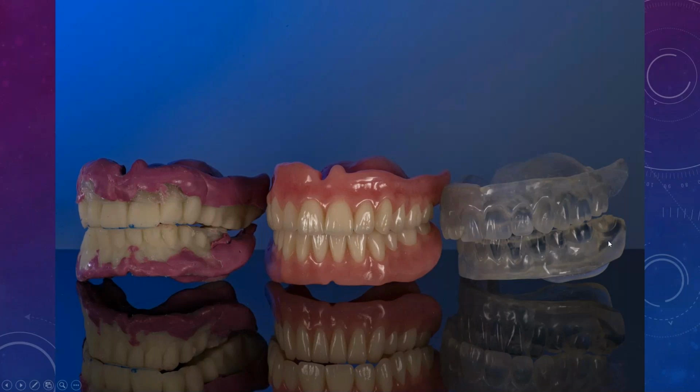Well, what happens when you change the bite like this, which is pretty drastic, and you do it very quickly? Patient doesn't have time to get adjusted to it, so the bite might actually shift from that point, which is exactly what happened here. So when we went to do the permanent prosthesis, it ended up being a problem. So what I recommend to you guys, if you have a situation like this, fabricate this denture, no problem, but have the patient wear that for a while. Make sure the bite's adjusted, then maybe remake it if you need to, and then use that to do implant placement, okay? Because if this is a class 2 right now, and all of a sudden the patient's actually class 3, or class 1, and then now they are class 3 or maybe class 2, then it's a whole different story for implant placement, guys. Okay?